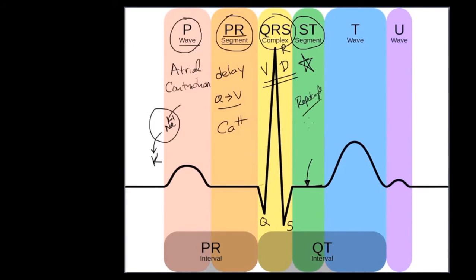And then finally the T wave, where there is the greatest amount of something called rapid repolarization. So basically this is what's occurring in the atrium over here, but it's so large over here because there's so much more myocardium in the ventricles as compared to the atria.